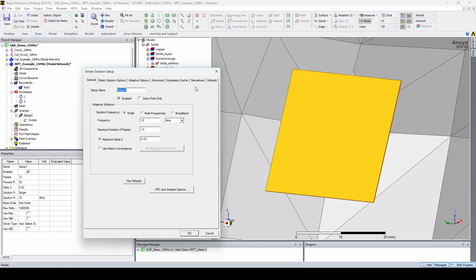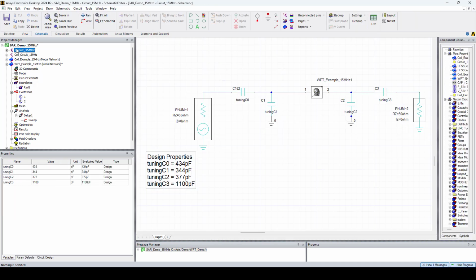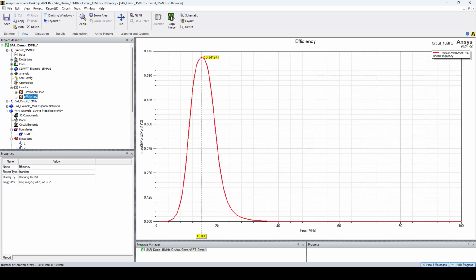The model is first simulated in HFSS and then dynamically linked to circuit where tuning capacitors are added to the design. So if I go to circuit, this is the circuit schematic with the tuned capacitors. We have a good resonance at 15 MHz, a return loss better than minus 19 dB, and an insertion loss of minus 0.75 dB, which corresponds to an efficiency of 84%.